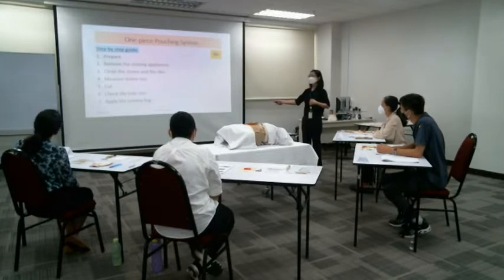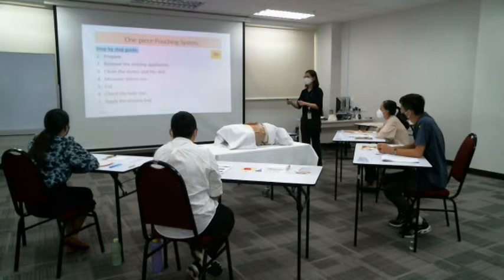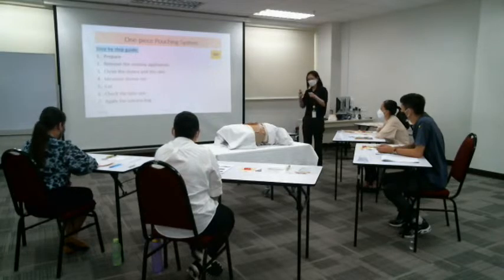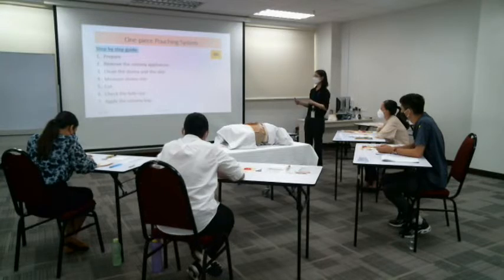Clean the stoma, clean the skin. Okay, so remove, clean, and then after that, measure the stoma size. You want to fit the new bag, so you measure. After that, you cut. So you cut on the plastic sheet that is given to you, and you measure and cut on the stoma bag, cut two places, and after that, you check the hole size. So after I have cut, I check again on the hole to see whether the size is okay, not too small. I can trim some more.